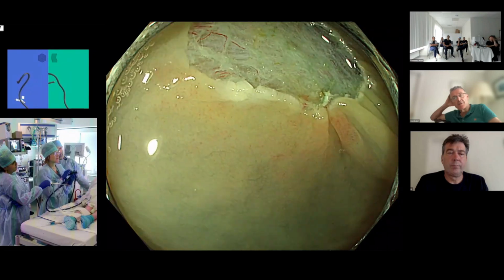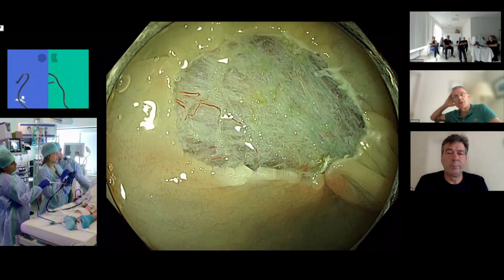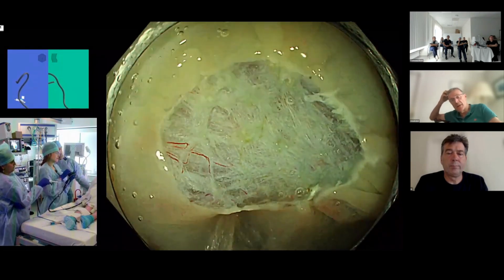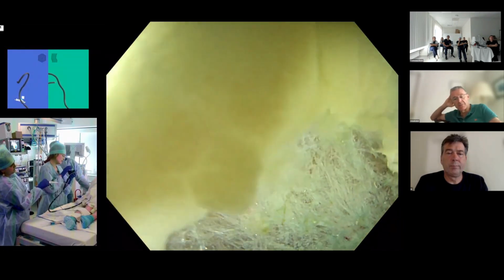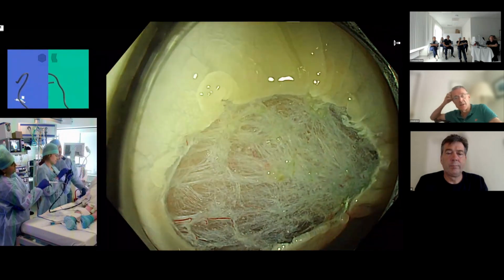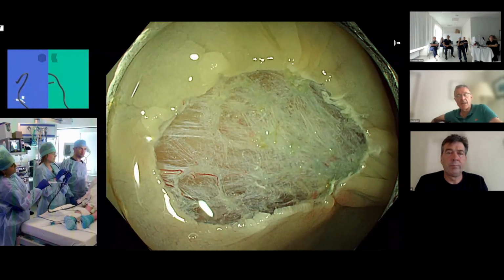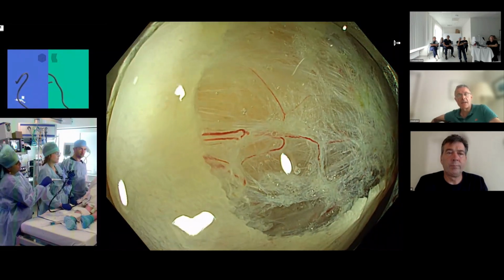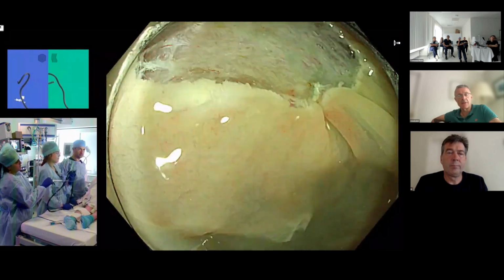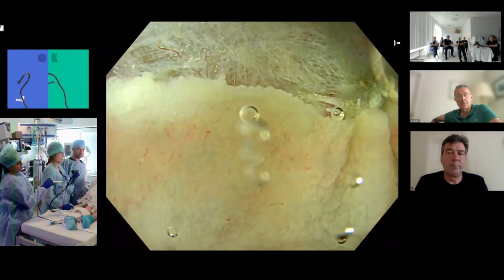And if you want to, you can get the cap right onto the lesion, press the water, and just do it all underwater with the magnifier. Near focus is this one. Near focus, yeah. Is it on? I can't see. Oh, it is, yeah. It was not, now it is. Okay, so go really close, push the cap on the wound, and then put water in there, and try and hold it there, and just have a look at those edges, and they look pretty good.